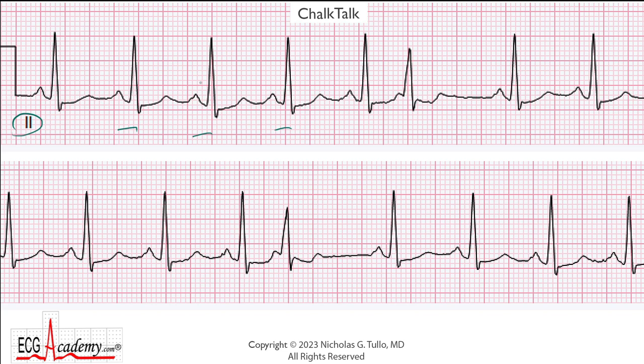We know what an FLB is — it's a funny-looking beat, but it clearly comes early, and then it's followed by a couple of other normal-looking beats, and down here it's the same thing. You have this premature beat. Let's take a look at the normal beats first and measure some intervals and do some basic stuff here.